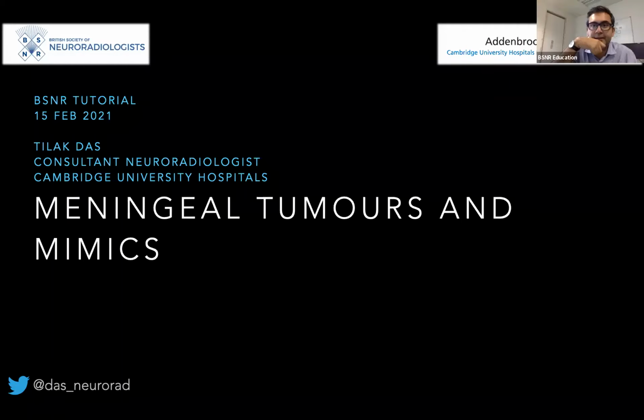How to differentiate meningioma recurrence from post-surgical changes? We generally just do conventional sequences and follow up over time. But I showed you a case where we used methionine PET to look at that.